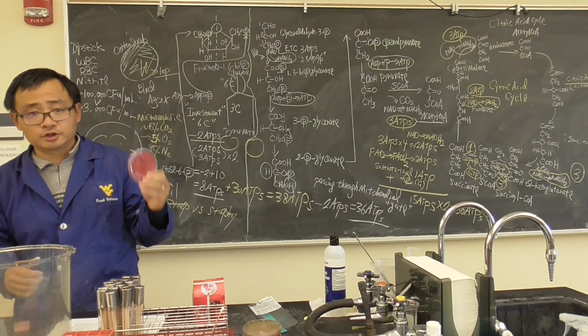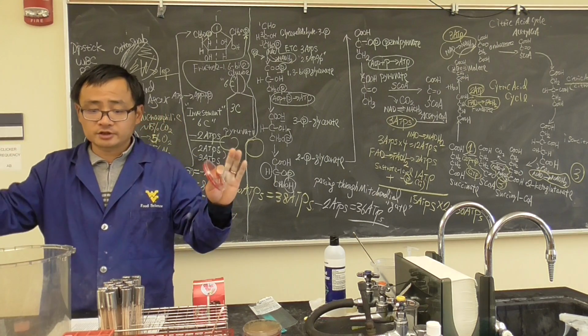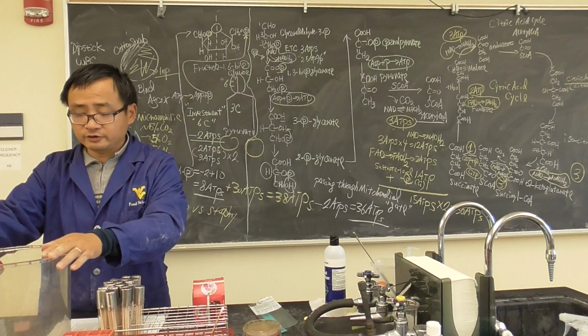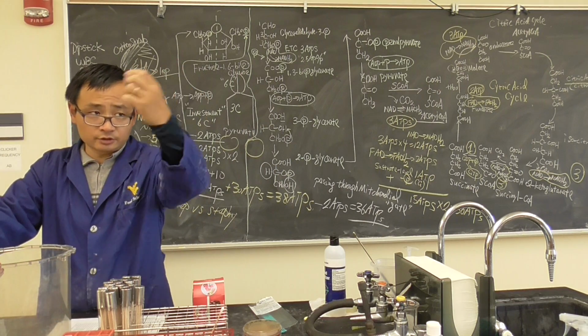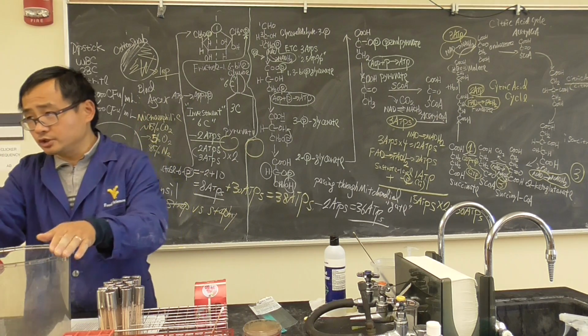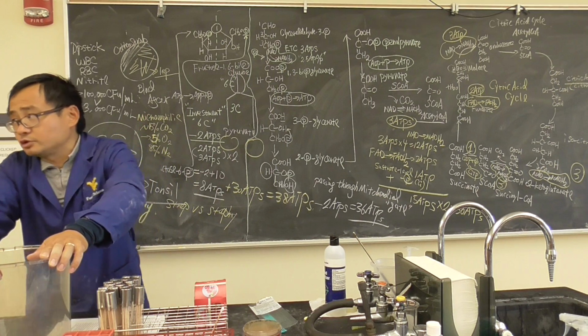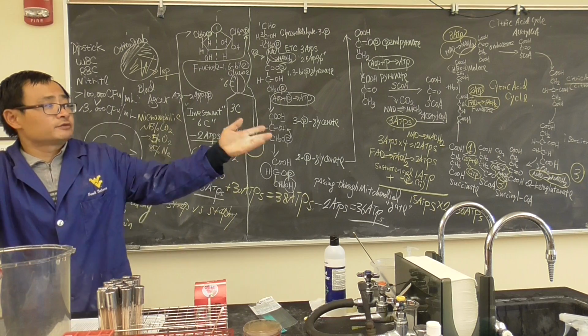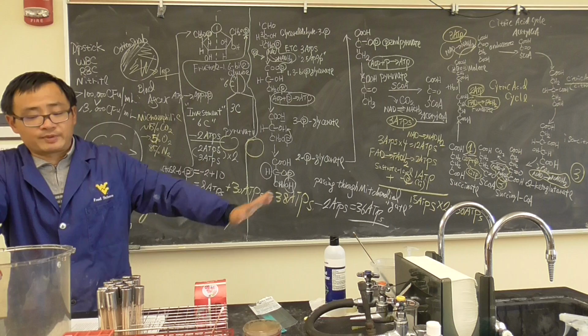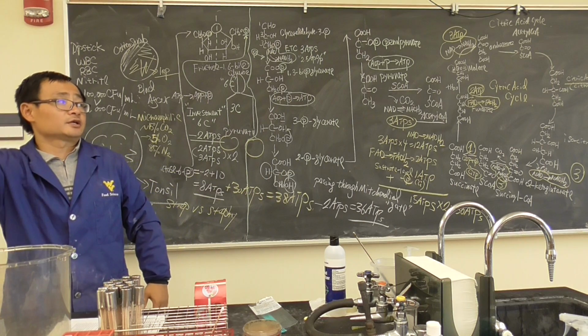So today you only need to work together. Wash your hands, wear gloves to get your patient sample. Same, put it right here. Once we have two labs, we're going to use a candle jar for the incubation. The jar will be incubated at 35 degrees Celsius for 24 hours. But you guys have to take it out tomorrow afternoon and put it at room temperature, otherwise it goes bad, because this is blood agar.